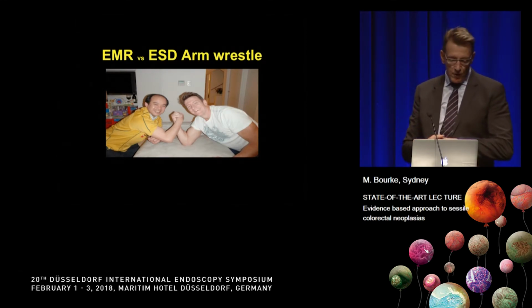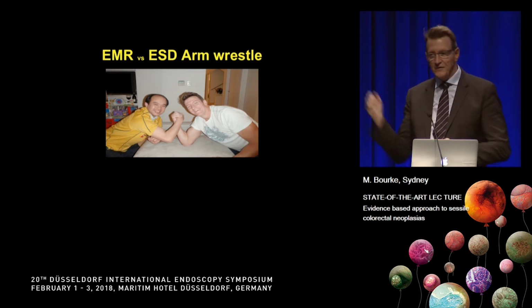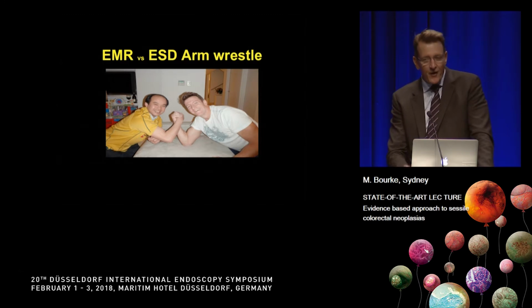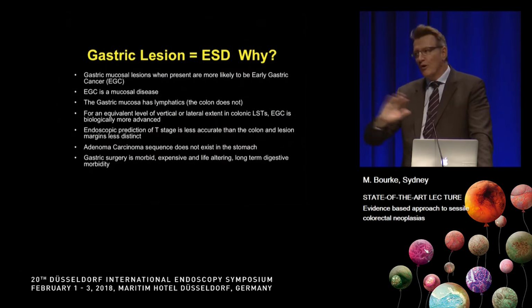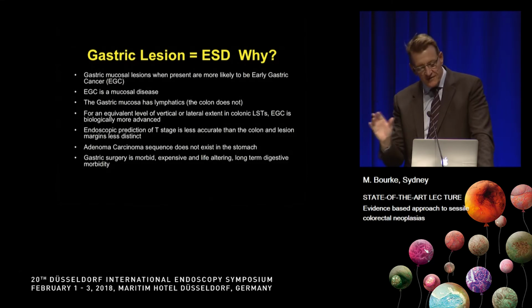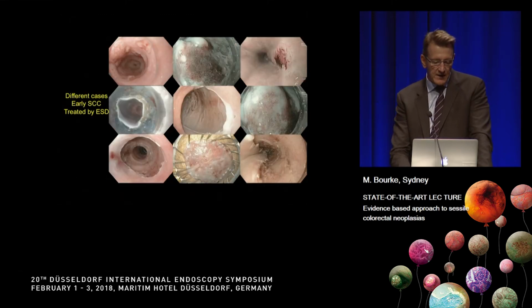Finally, what about the role of EMR versus ESD? So Professor Yahagi nailed me at this arm wrestle. He's a very strong guy, but I have the data on my side. So we do a lot of ESD, and it's a completely different situation in the upper GI where ESD was developed. Of course, any demarcated dysplasia in the stomach should be treated by ESD, and a lot of lesions in the esophagus need to be treated this way.